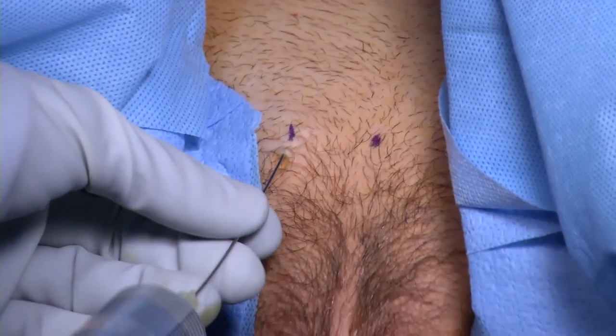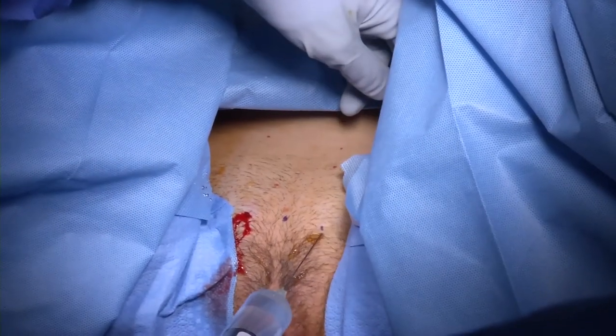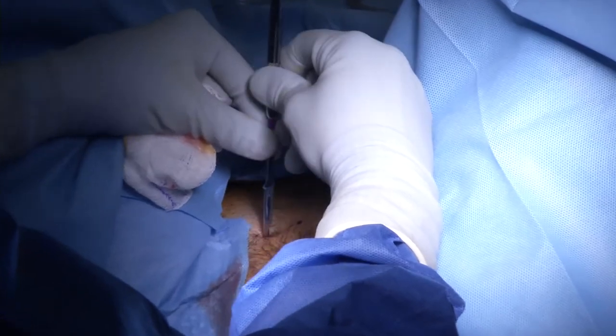30 cc's of 0.5% lidocaine is used to infiltrate the retropubic space and along the tract where each trocar will pass. Stab incisions are made with a 15 blade.